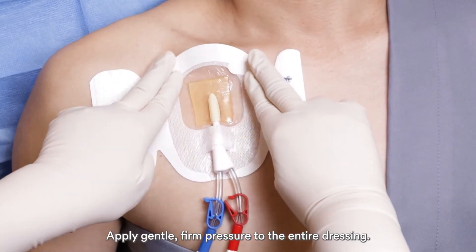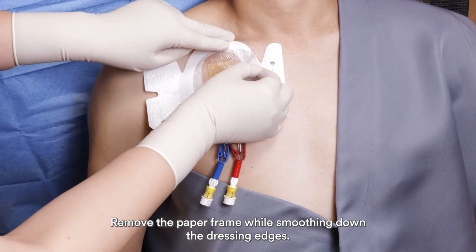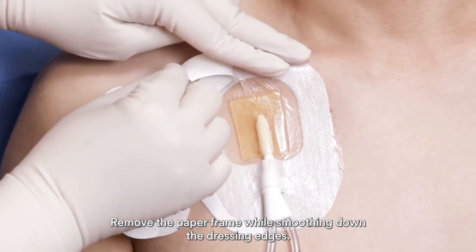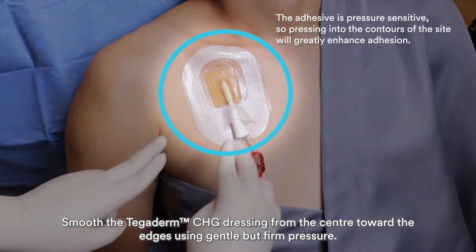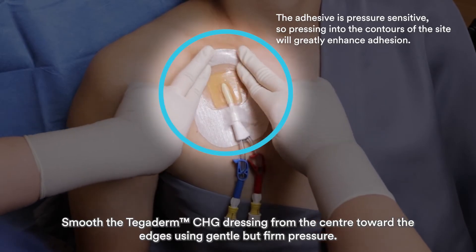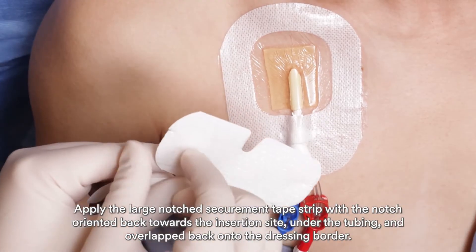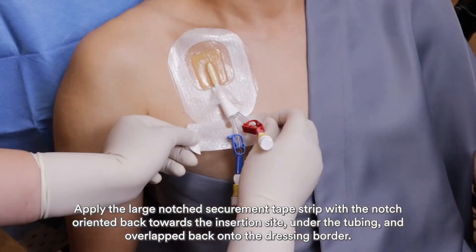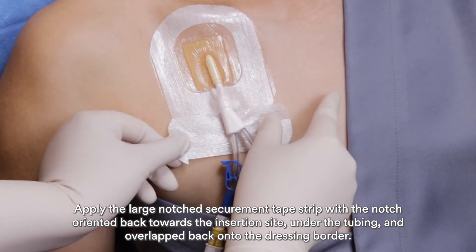Avoid stretching the dressing to reduce the risk of skin trauma. Apply gentle firm pressure to the entire dressing. Remove the paper frame while smoothing down the dressing edges. Smooth the Tegaderm CHG dressing from the center towards the edges using gentle but firm pressure. Apply the large notch securement tape strip with the notch oriented back towards the insertion site, under the tubing and overlapped back onto the dressing border.